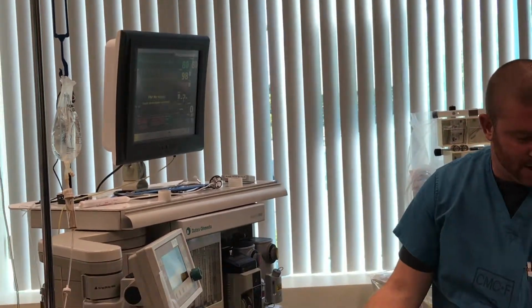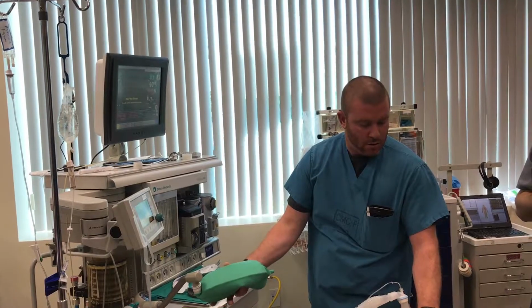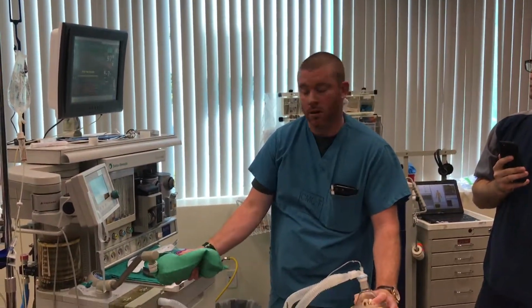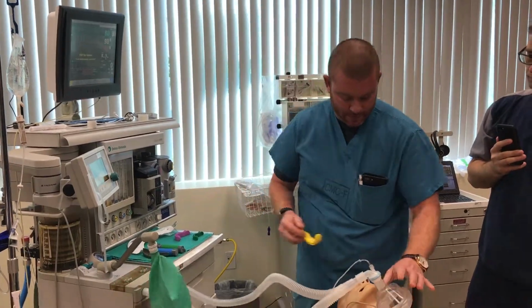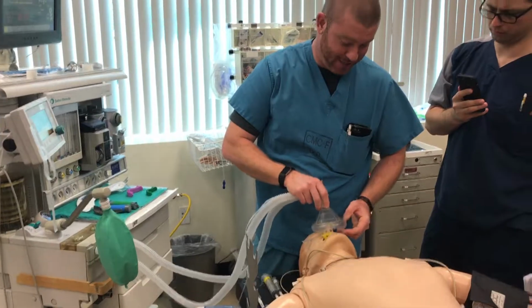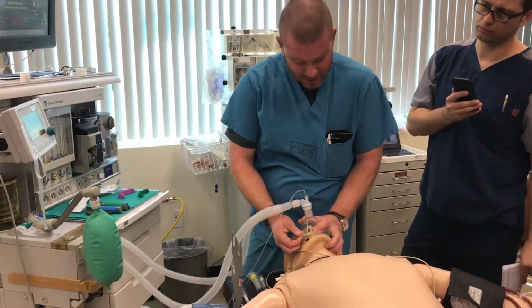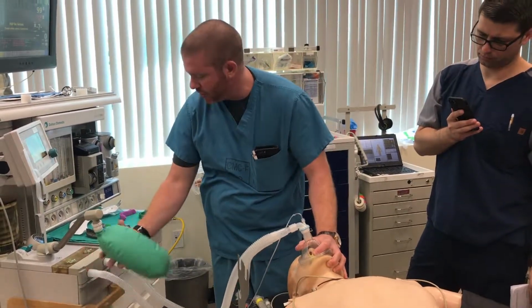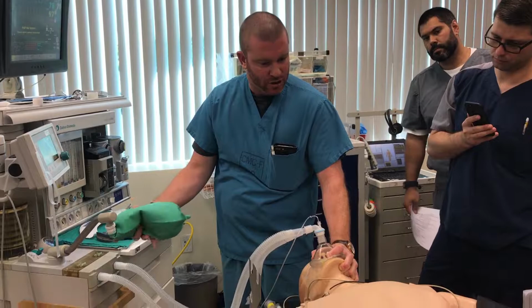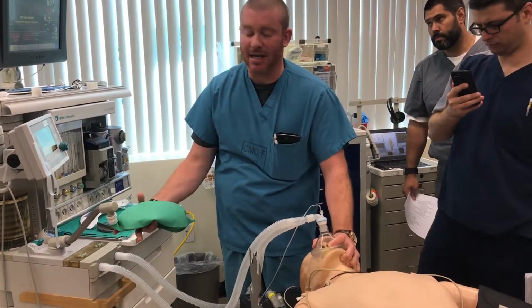I'm going to try to ventilate the patient. What if you can't ventilate the patient? What are you going to do? Great. Oral airway. This is going to be the hardest thing that you guys have ever done. I know you guys think, I've done a lot of codes. You just haven't ventilated, especially with an anesthesia machine. You're going to make a seal, and you can ventilate him. You'll see end-tidal CO2 or chest rise if you can. And I'll get you an easier mask I have over there to use.